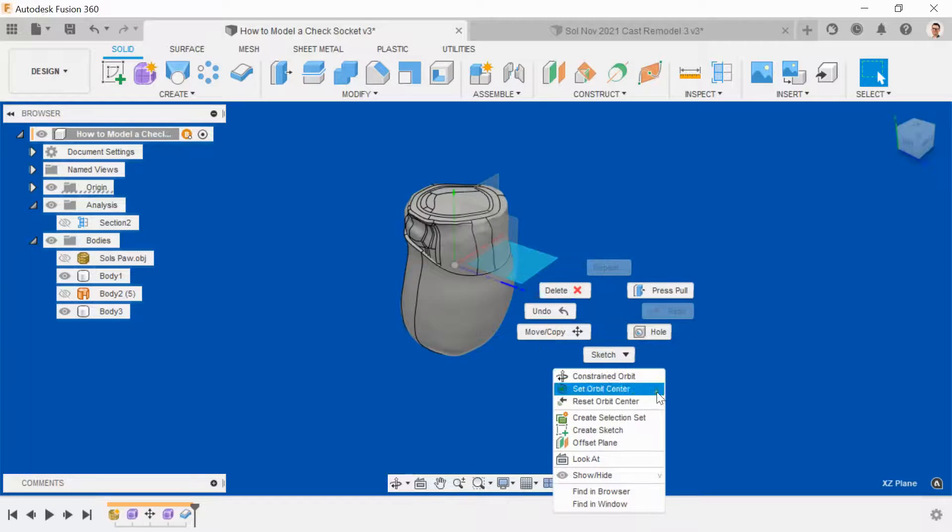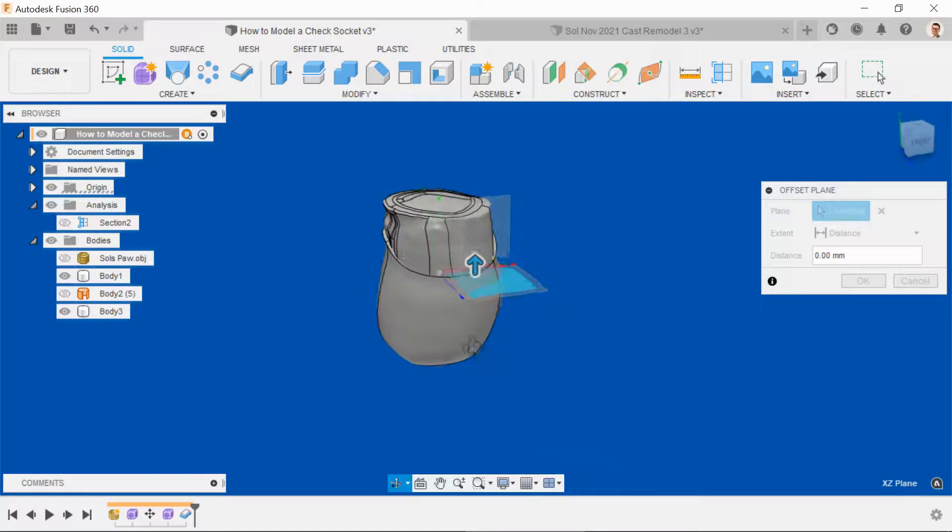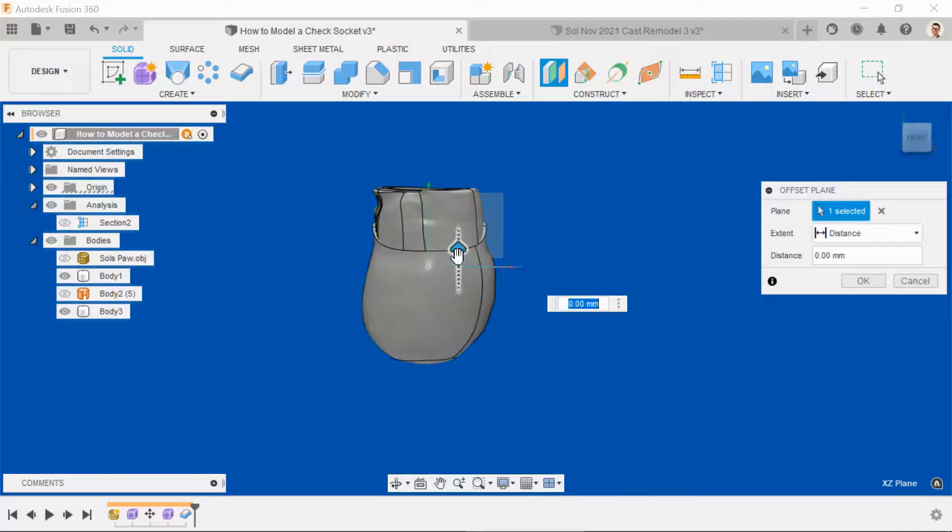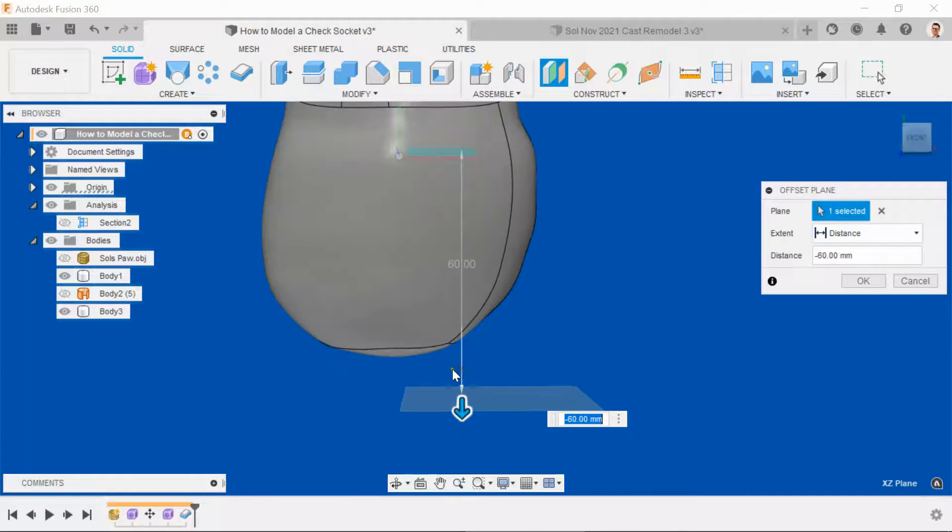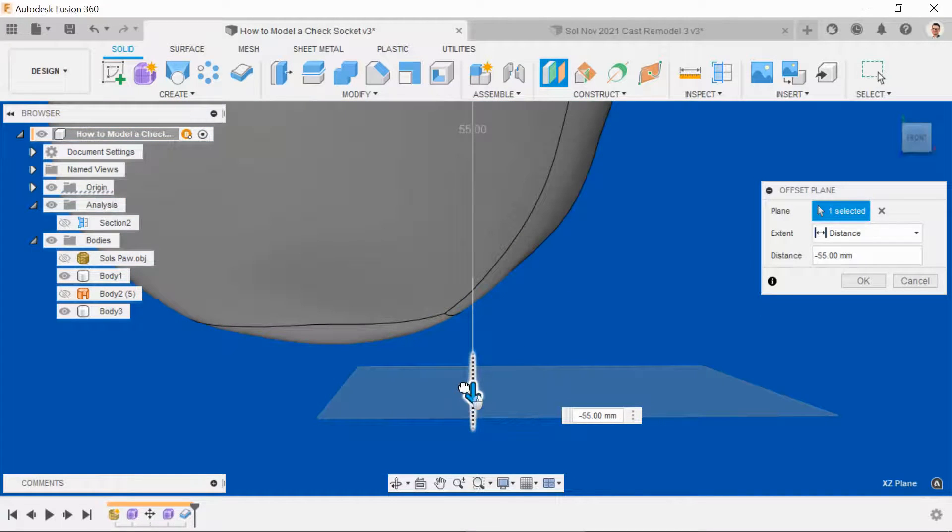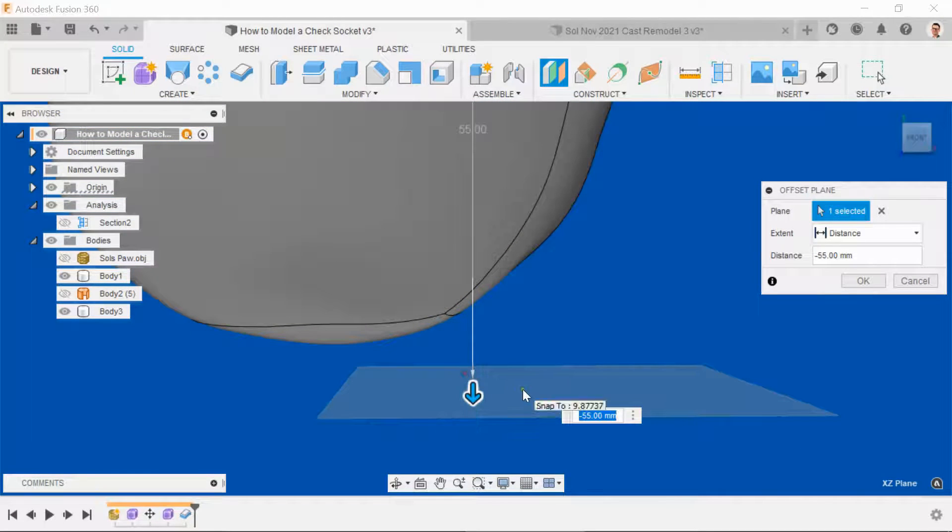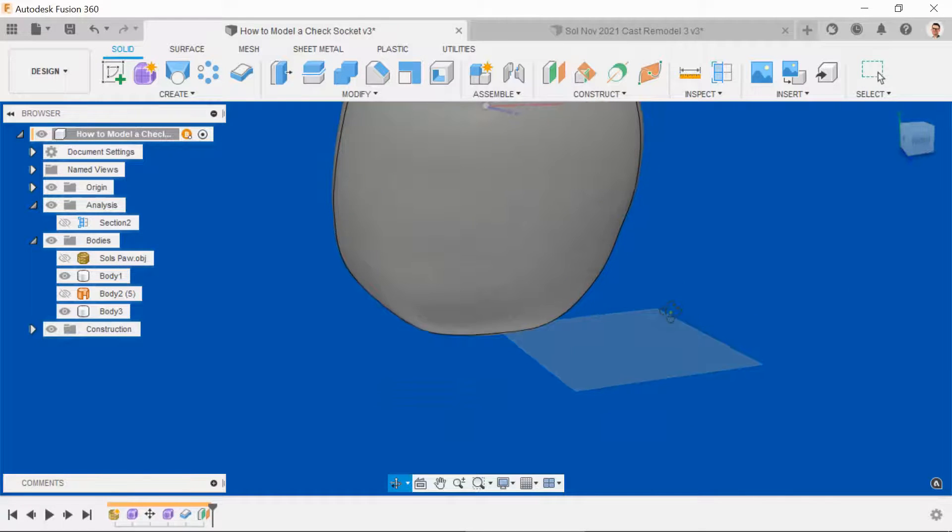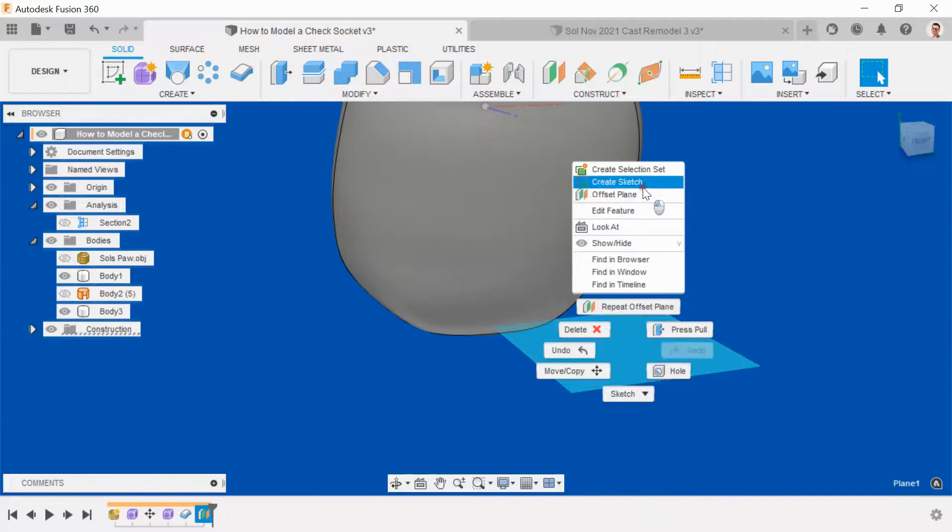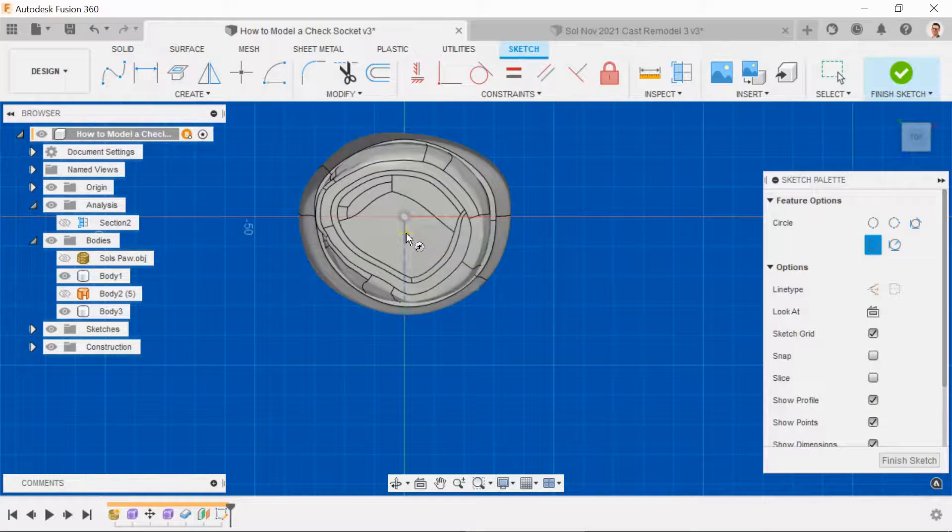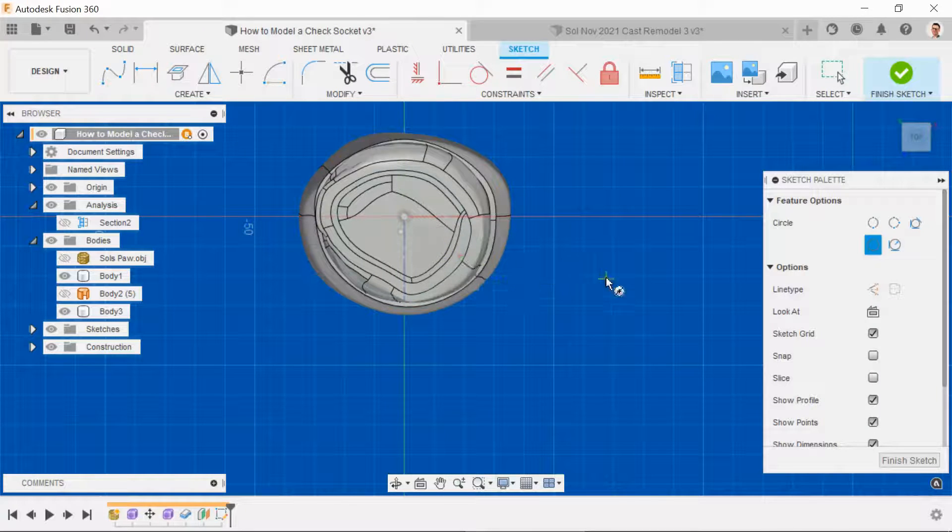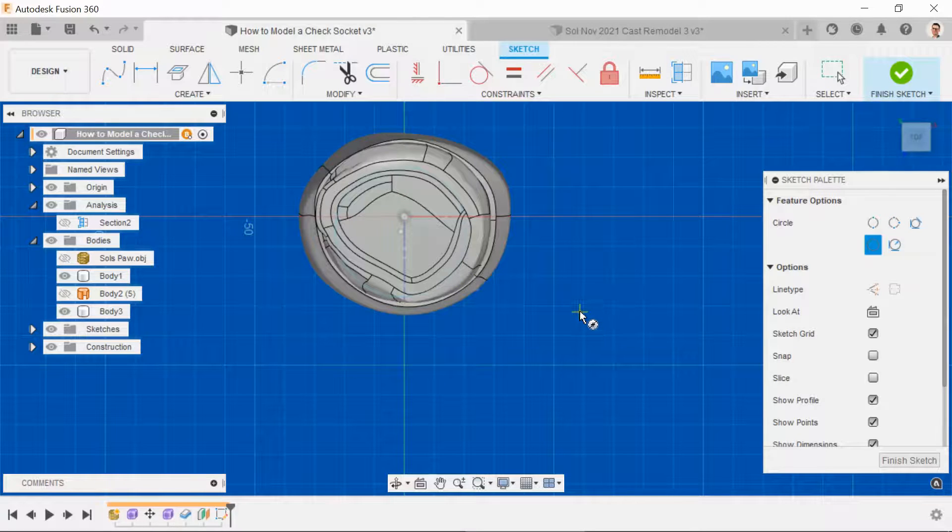So right-click on the ground plane, offset the plane, looking from the front, bring the plane to just below the base of the socket but not too far. OK that, and then create a sketch on that plane. What we want ideally is a circle. I don't like to put it on the origin because I don't want it to constrain itself there.